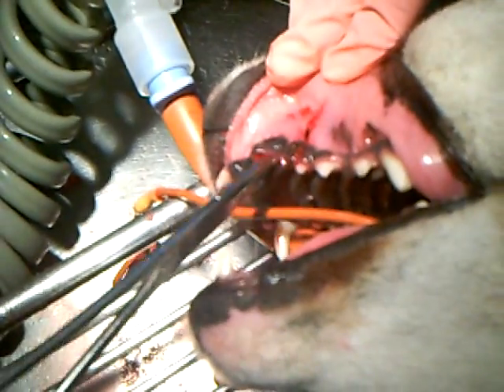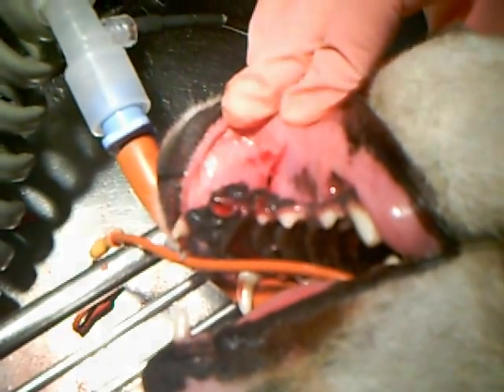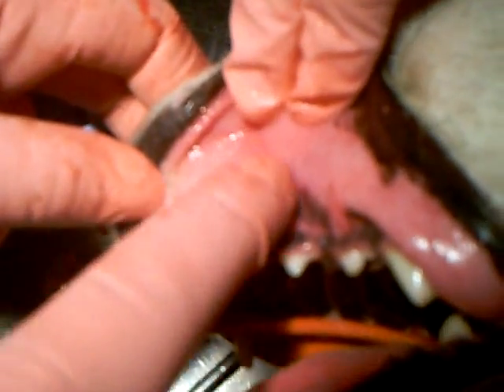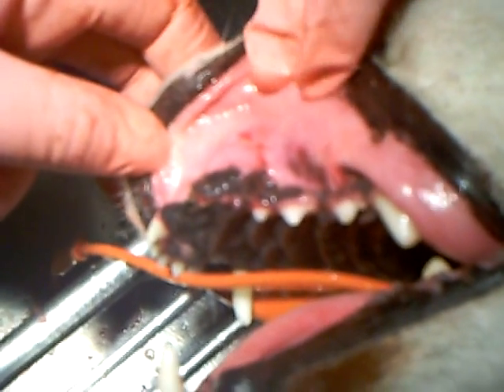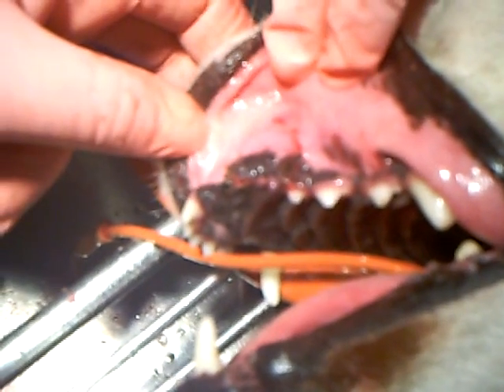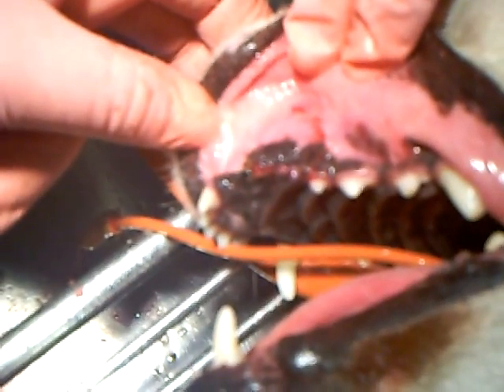And then all the way across this way where the incision went. That'll make a nice tight closure in that area so that it has time to heal without getting an infection. Now you can see that this entire suture line has been closed, and it looks as though there has never been a tooth there. She'll be on soft food for about a week, and then we'll recheck it to make sure it's healing properly. But that's basically how we extract a tooth that needs to come out.